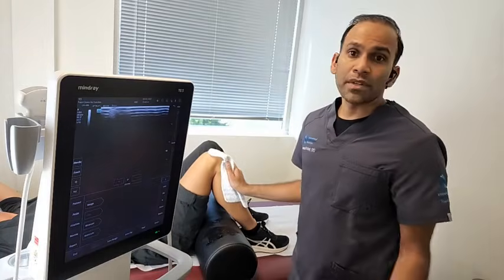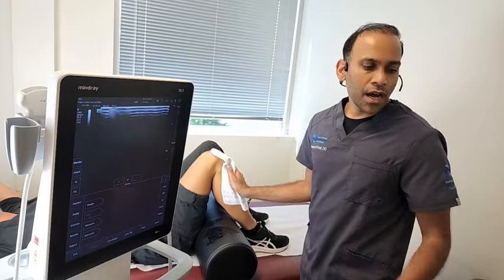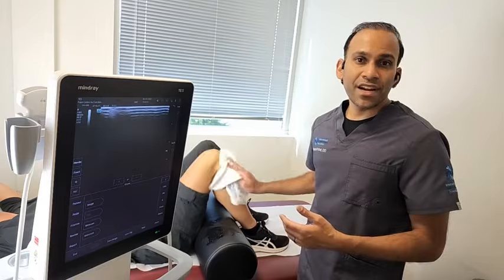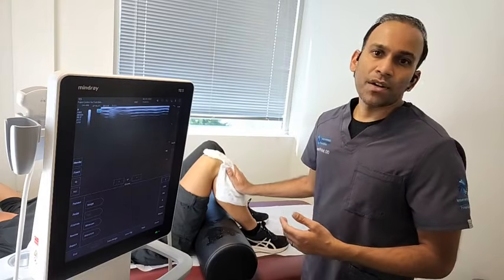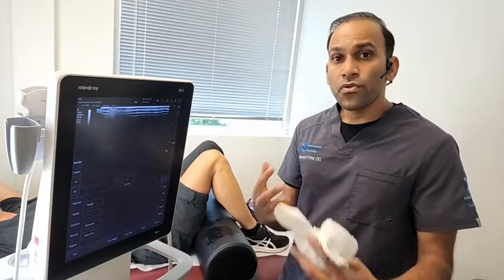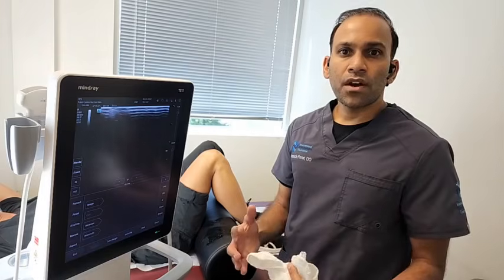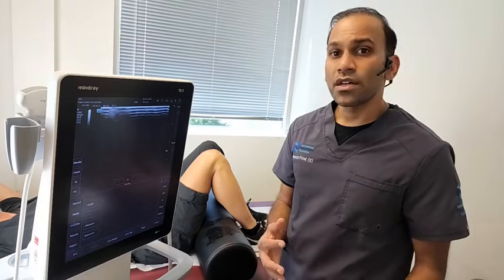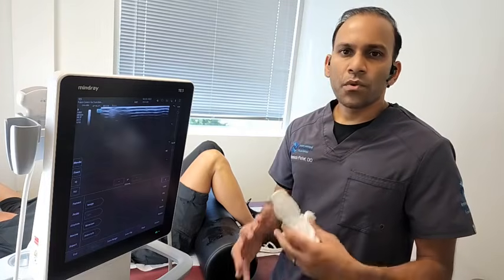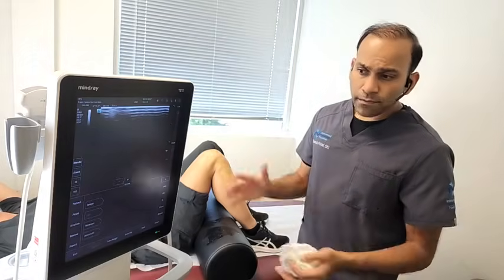But there are limitations. You know, we can't see some of the depth of the joint. Some things like the deep portions of the meniscus, if there's tears that are deep inside the knee, we're not going to be able to see that with the ultrasound. But if we combine ultrasound with a thorough physical examination and listening to the patient and figuring out what it was that caused the pain in the first place, we're often able to make a really solid diagnosis with a combination of things. So I hope that all made sense.